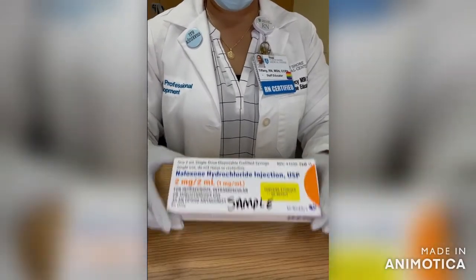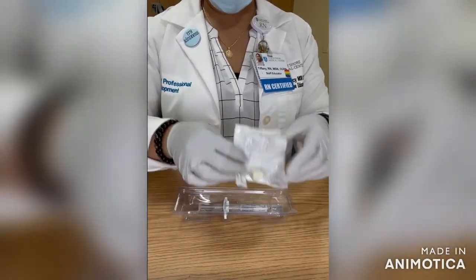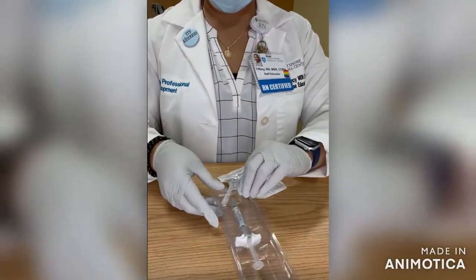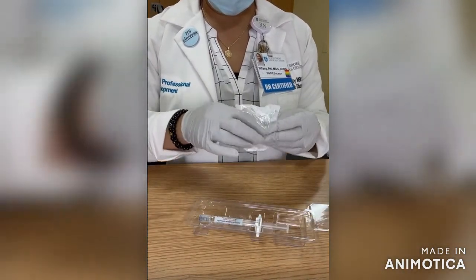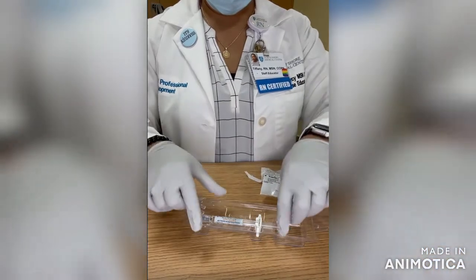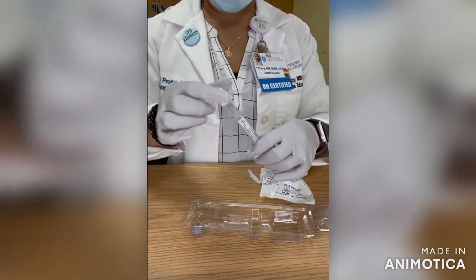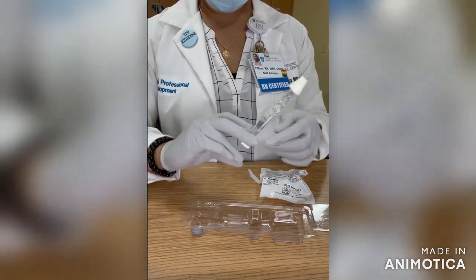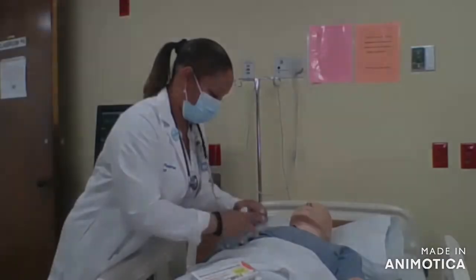Now we're going to show you how to put together a nasal naloxone rescue kit. First, remove the contents from the box. Inside, you will find a syringe of naloxone and a nasal atomizer. Remove the cap from the syringe of the naloxone and apply the atomizer. Now you are ready to administer. When you press the plunger, a fine mist will eject from the syringe.